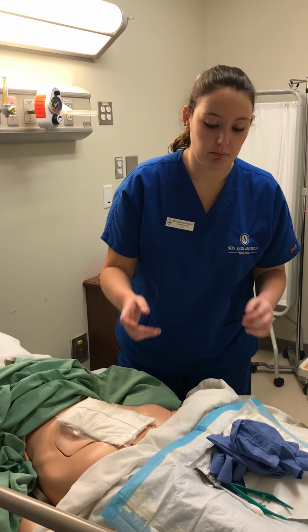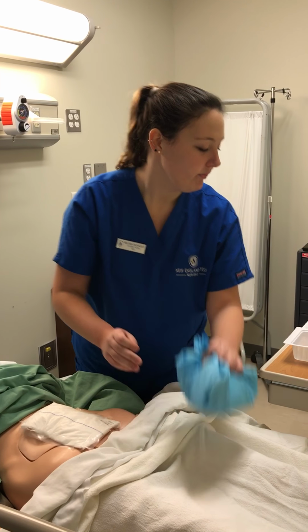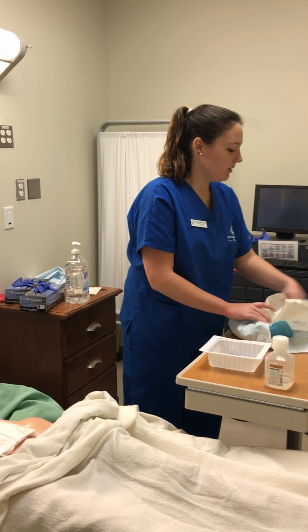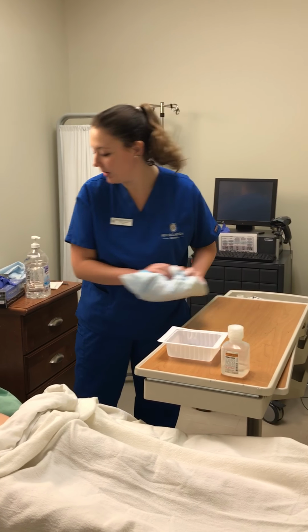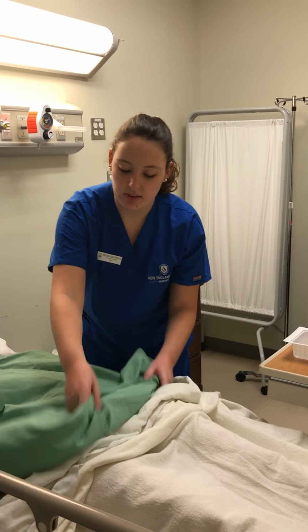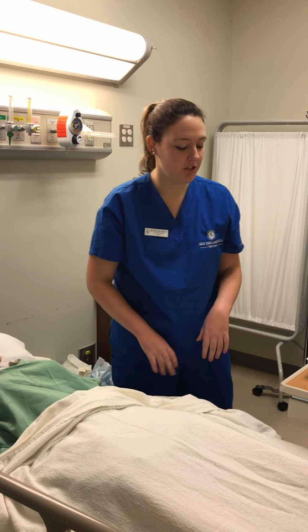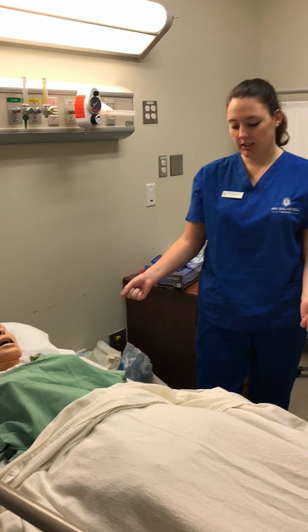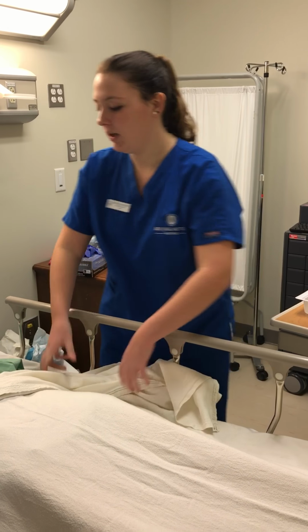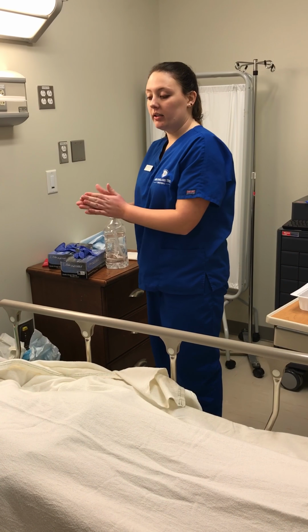Okay. Next, I'm going to clean up my supplies. Discard my material. And then I'm going to restore privacy to my patient and comfort. I'm going to put my patient in the lowest position of the bed, put the side rails up, and wash my hands. And that concludes the dressing change.